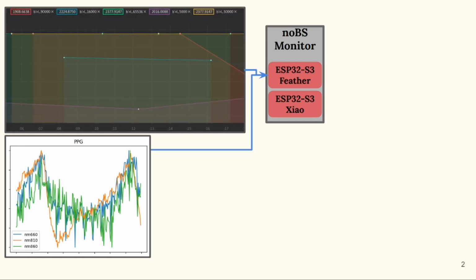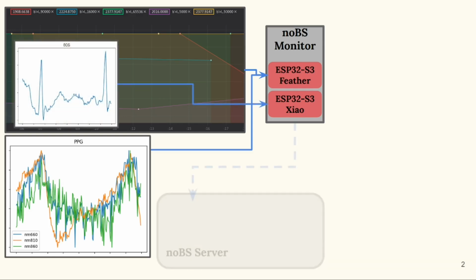The second sensing method, bioimpedance, measures the reactance of the skin, flesh, and blood by passing a weak electric current called the stimulation signal through the user's finger. By measuring the effects of the finger on the magnitude and phase of the stimulation signal, we can gather information about the makeup of the bloodstream. The NoBS monitor measures bioimpedance at 5 distinct frequencies, as shown here.